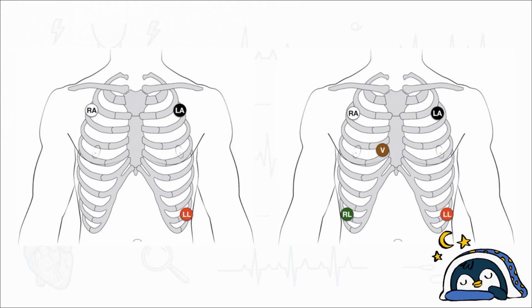The 3-lead system relies on exactly 3 electrodes: right arm, left arm, and left leg. And a great tip here is that to get the best monitor display for bipolar leads I, 2, and 3, we actually want to place these electrodes on the chest wall, equidistant from the heart, rather than way out on the specific limbs.